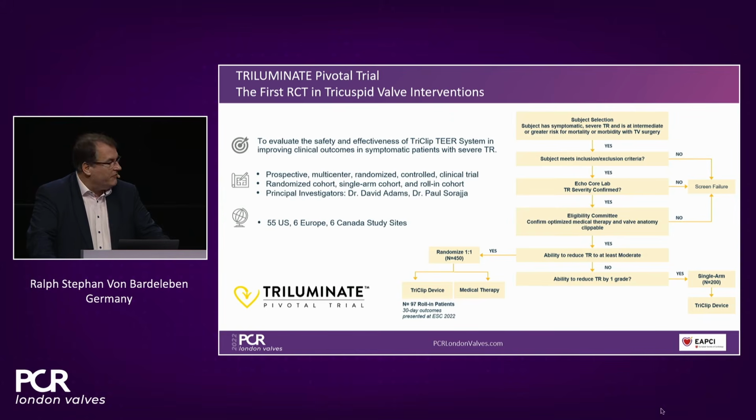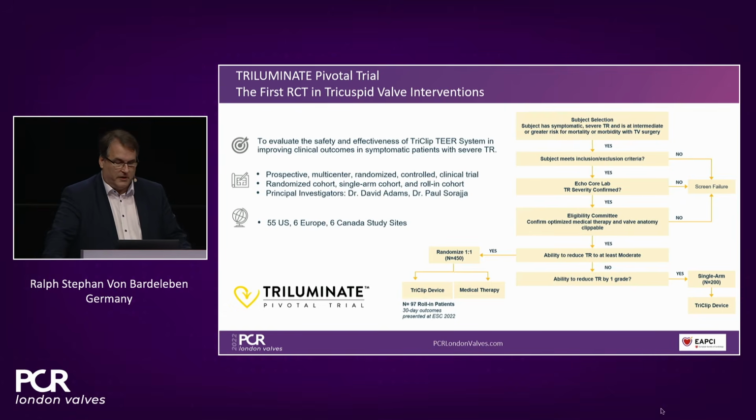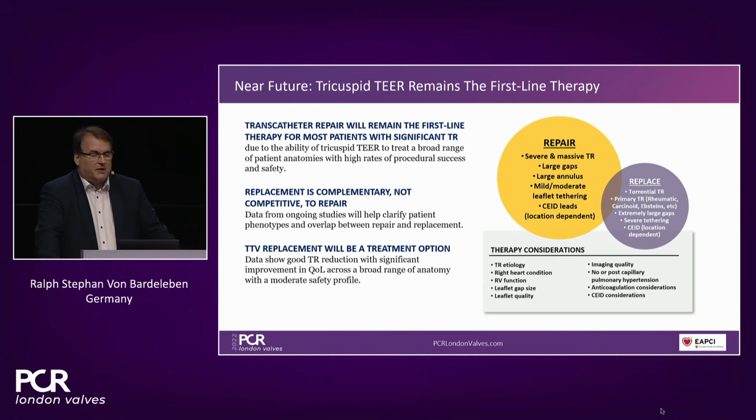So we will learn for the first time in a randomized cohort what medical treatment can produce and what additional device therapy will give us as an additional benefit. This is a group of 450 patients enrolled in a randomized fashion 1-to-1, and we're highly interested to see this result in 1 year's time.